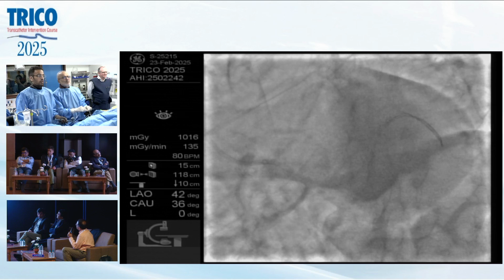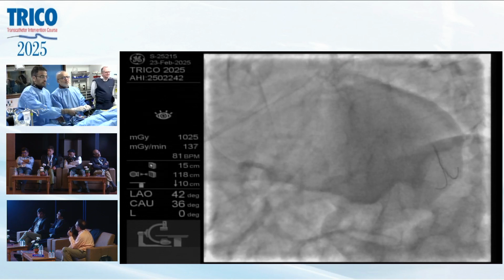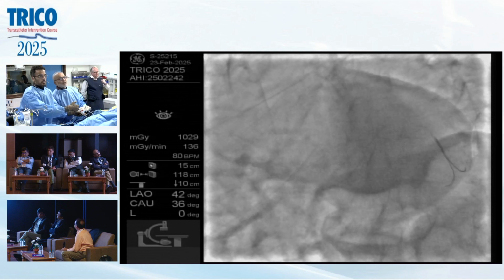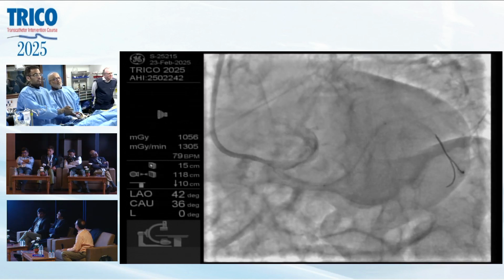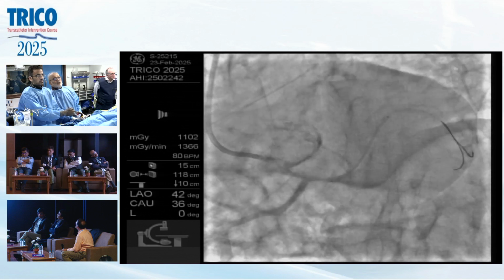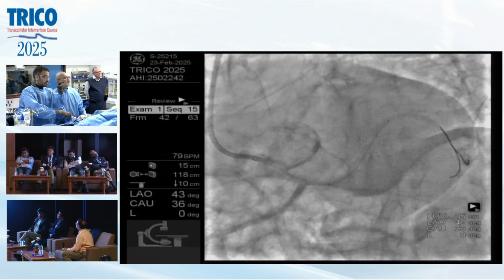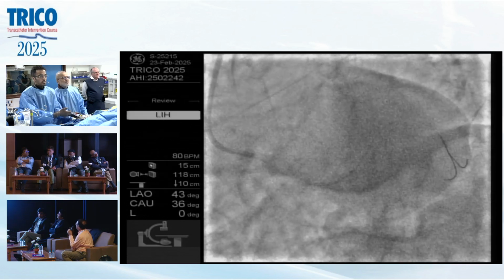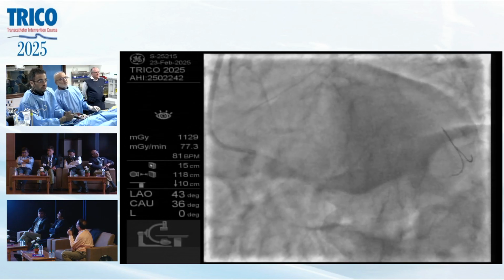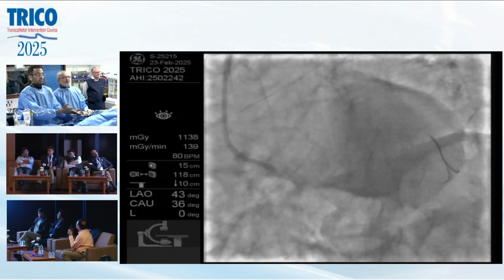I think we have crossed. I think you're at the distal landing. Inject. We are non-selective. It looks good. No, we need to go a little bit. No, that small branch is there. I think Aman is right. I think you're still proximal. I'm pushing my guide in. Yes. Now we can take a selective view.